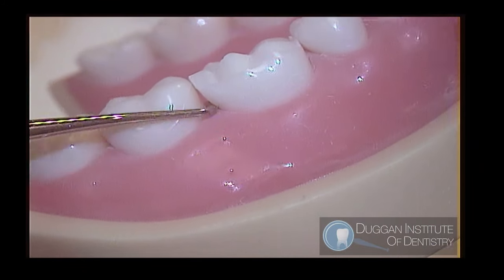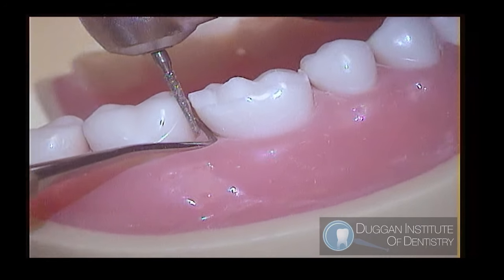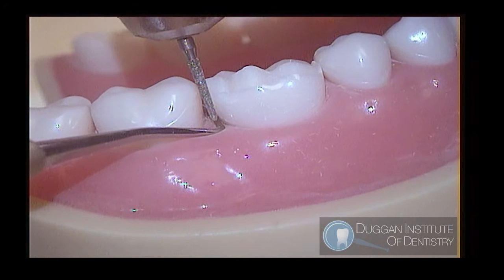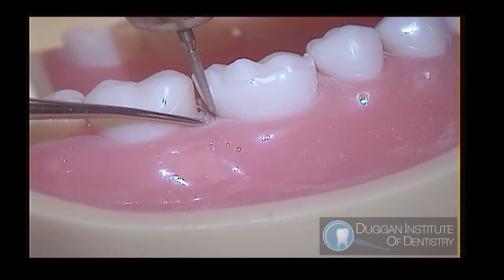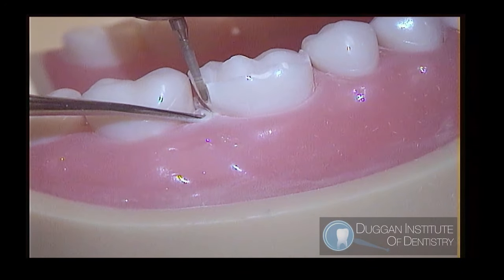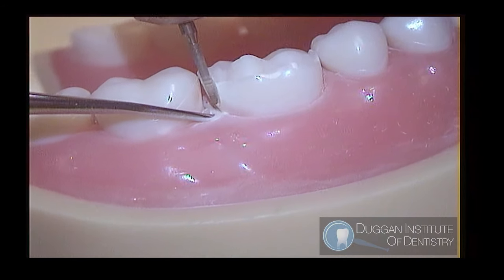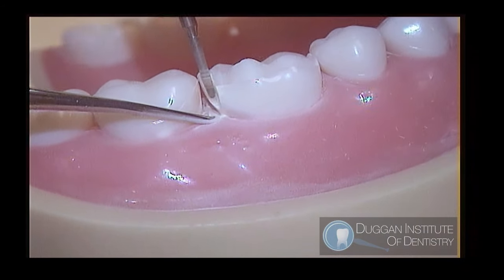Now we move on to the proximal axial reduction. Tilt the patient's head away from you. Look directly at the proximal area. Be aware that the gingiva rises within the embrasures. Proximal reduction should be between 1 mm and 1.2 mm.